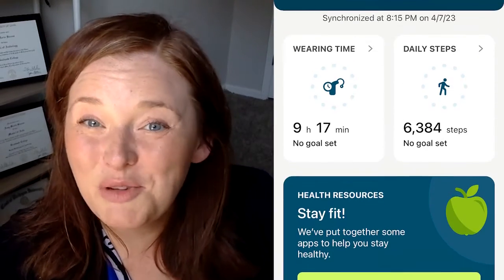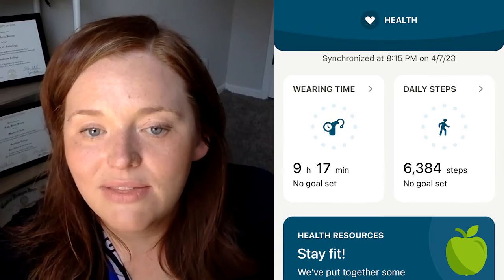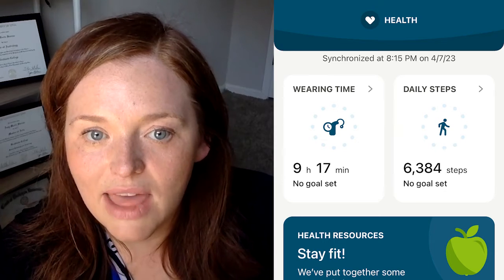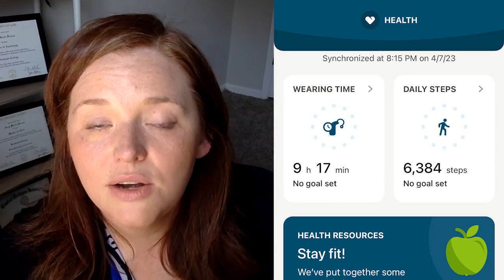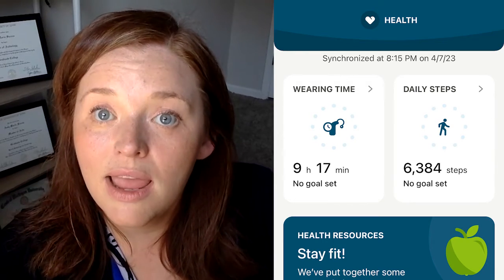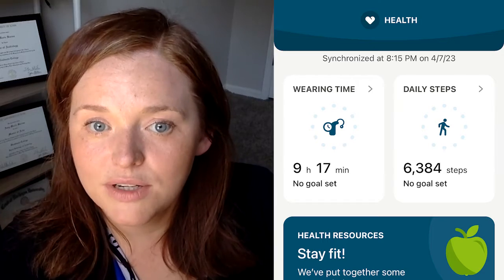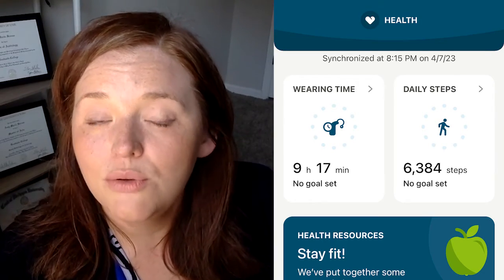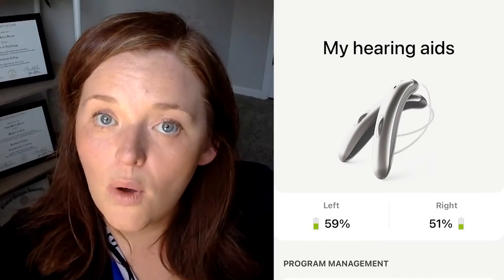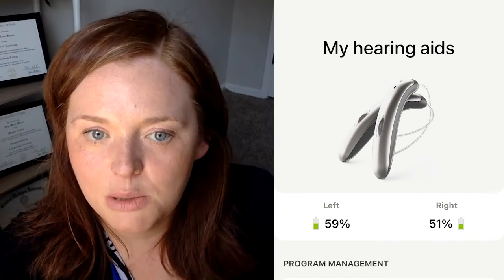If you like to keep track of your steps or other health data, this app also has those features in the health section. You can see your wearing time for your hearing aids and the number of steps you've taken that day. If you're interested in remote fitting, the app also has a remote care option — you'll coordinate this with your hearing healthcare professional. The app will also show your battery life so you can check if one hearing aid is draining more quickly than the other.